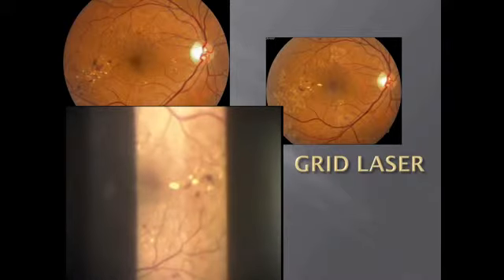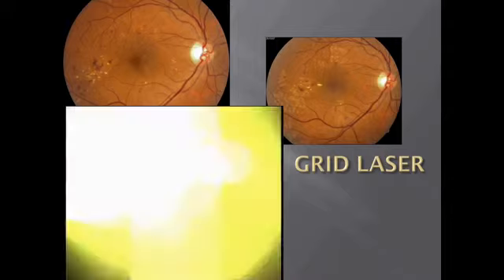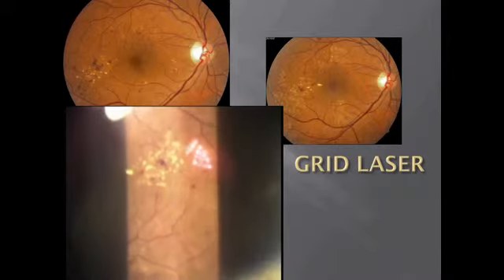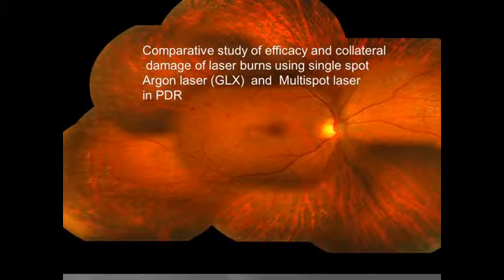So standardly one would use for PRPs these square-shaped patterns, usually 25 spots, 5 by 5, or you could reduce or increase it depending on what areas you are treating. So here you're treating areas in between previously treated areas, so the spots could be titrated accordingly. And when you do macular lasers, as I said, you could customize it based on the area of thickness that you see. So this is for the grid laser, where you can do a semicircle and then titrate the spots and treat only in a localized manner.